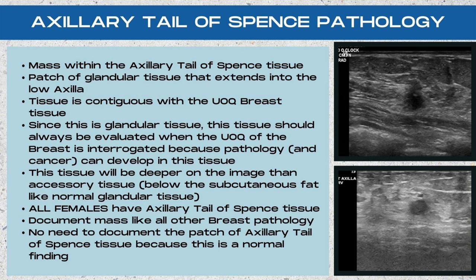All females have this axillary tail of Spence tissue, so it's important to evaluate it in every single patient when evaluating the upper outer quadrant of the breast. Document anything you find hiding in this tissue just like any other breast pathology — in two planes with and without measurements and with and without color Doppler. There's no need to specifically document the patch of axillary tail of Spence tissue itself, because this is considered a normal anatomical finding of the breast.